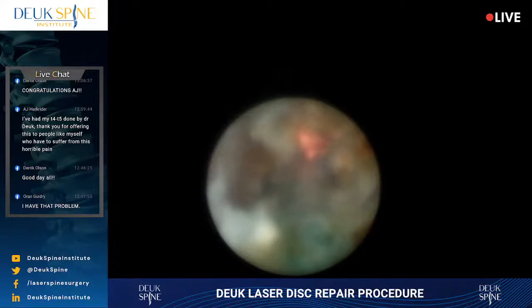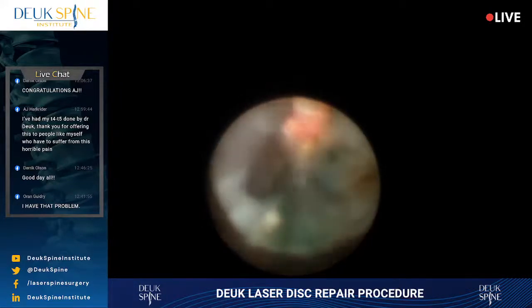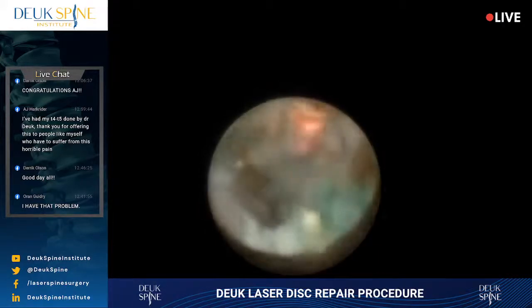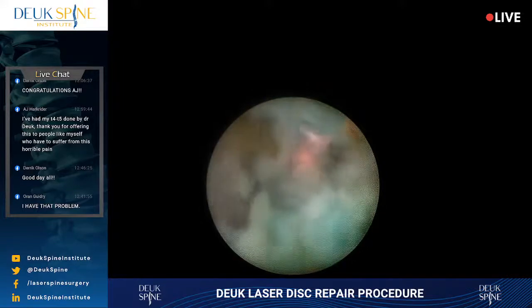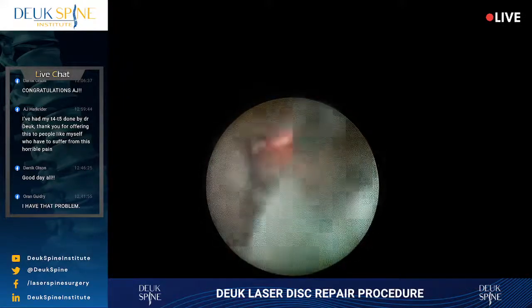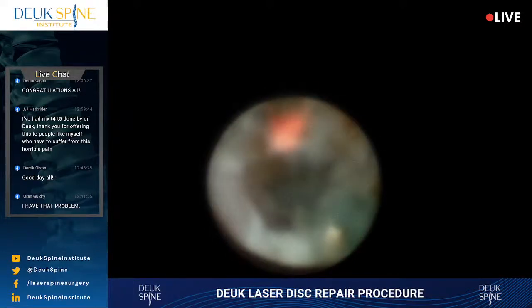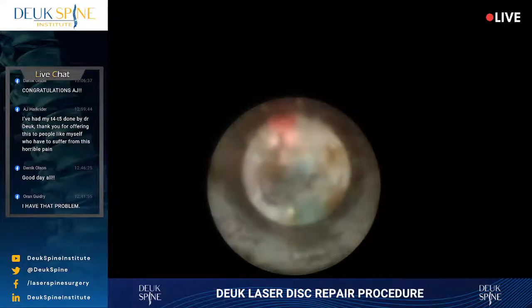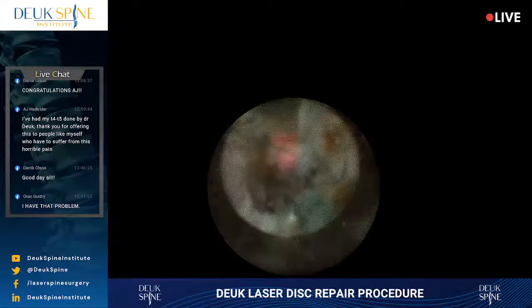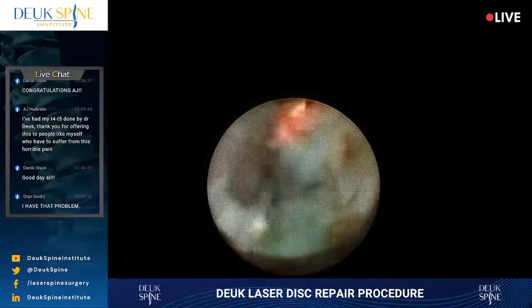Once again, you're watching a thoracic T7-8 disc herniation be repaired with the Deuk laser disc repair at Deuk Spine Institute. It's November 4th, 2021. This is our 12th or 13th thoracic laser surgery. And every one of our patients that we've done has had 100% relief of their pain. And one of them is on this broadcast. I didn't even know they were coming, but I'm so happy they're here.